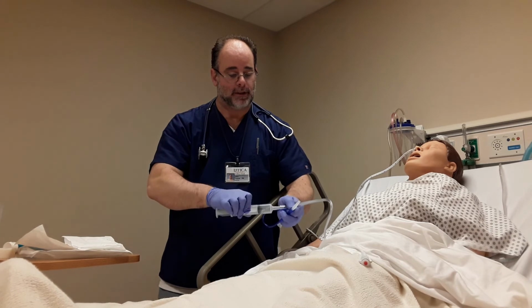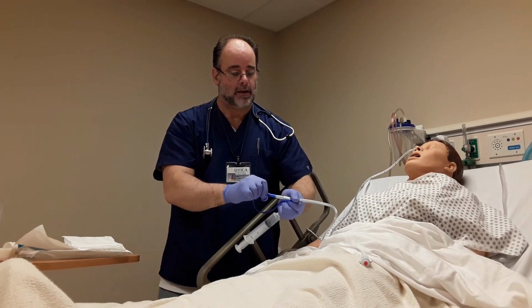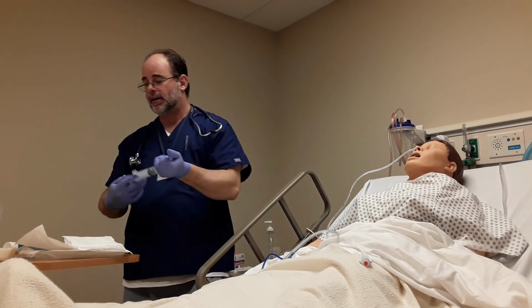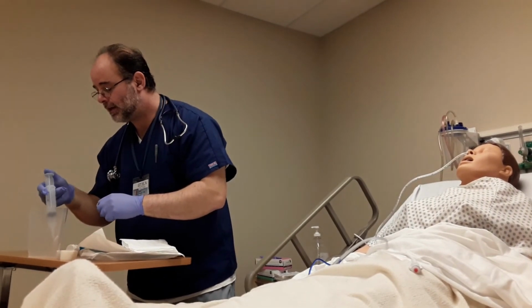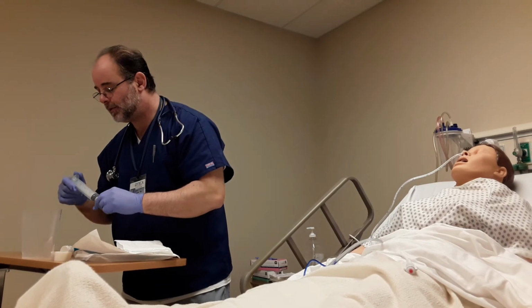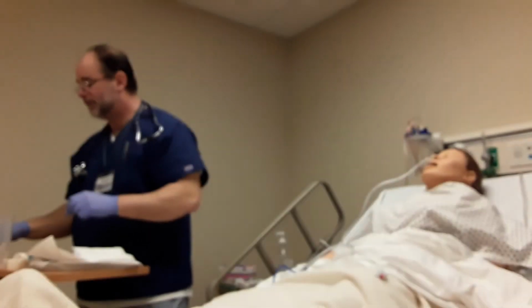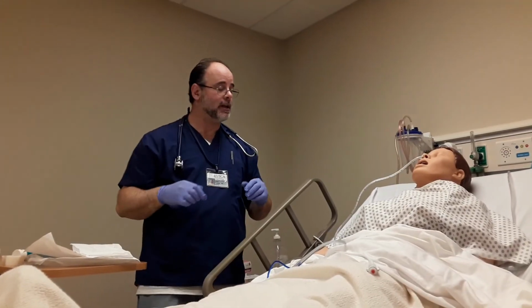So I will now disconnect that, place that there, and then quickly close off or clamp off the tubing as to not get gastric contents over the patient's bed in person. With this, I will take and do a check of pH, and the pH is between 2 and 5, so that would indicate acidity. So that would match up well with that situation.